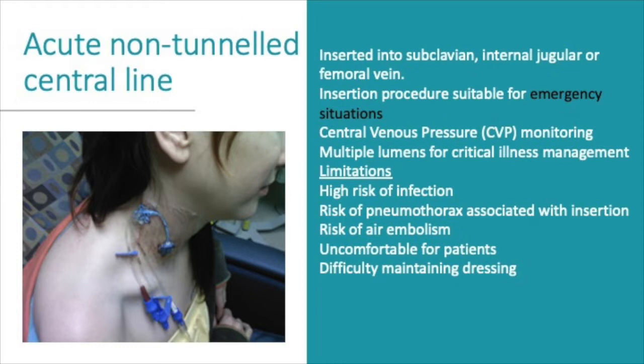When removing the line, you've got a little suture here, so moving it, just cut the suture, get the patient to hold their breath, and then take the line out. And then put pressure there and leave the dressing on for 24 hours.